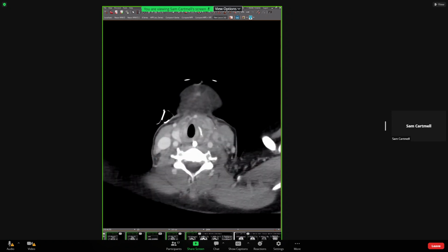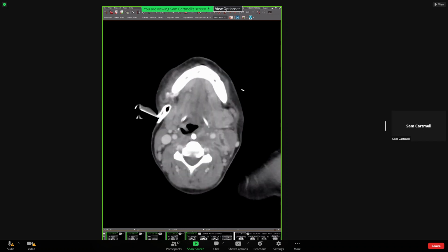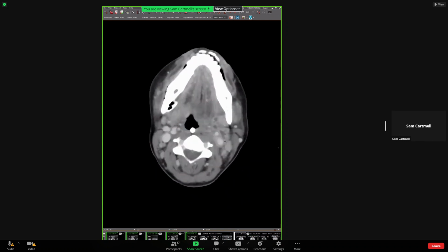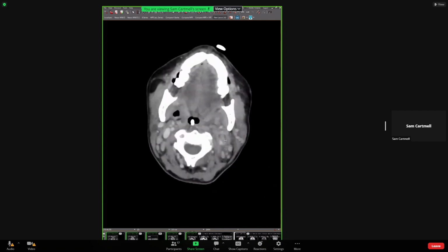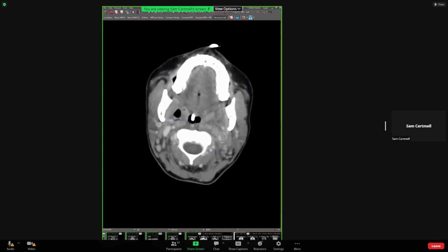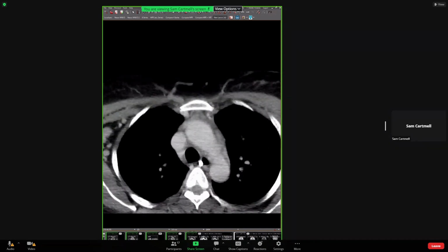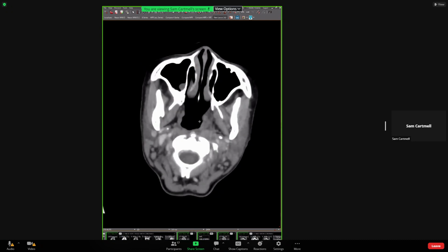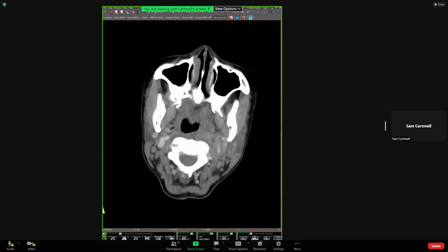but she's also got a little collection, and this would be in the parapharyngeal space, and then also involving, this is another case of Lemierre's, because we don't have a left internal jugular vein, and sometimes you can get spasm of the carotid artery too if there's an infection right next to it. And I think she eventually may have also developed intracranial, mediastinal extension. But anyway, good example of some of the complications that you can see after infection in the suprahyoid neck.